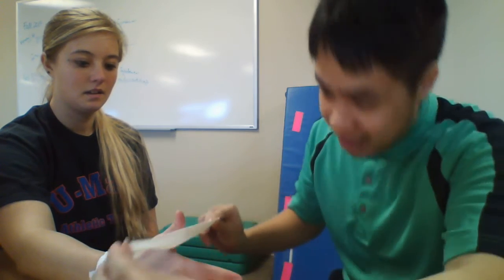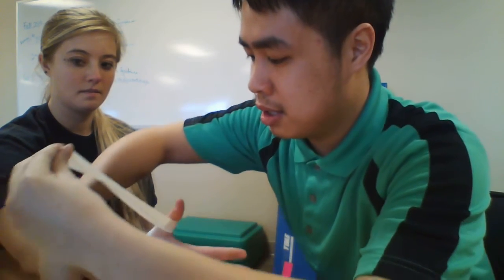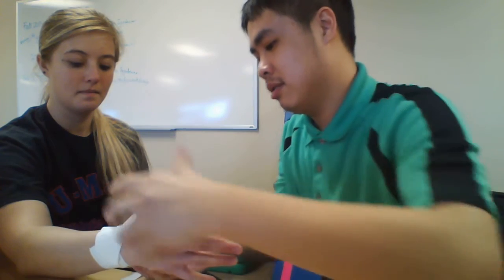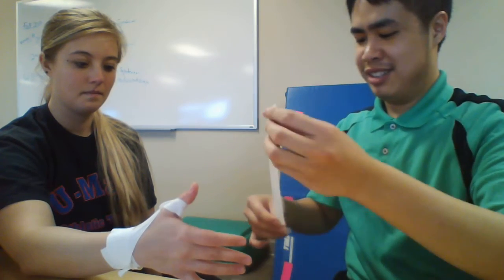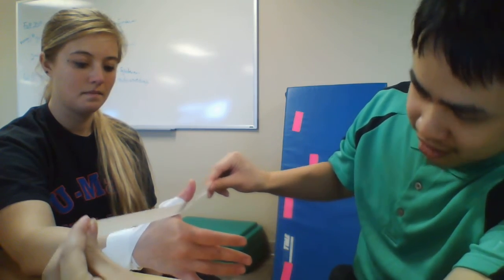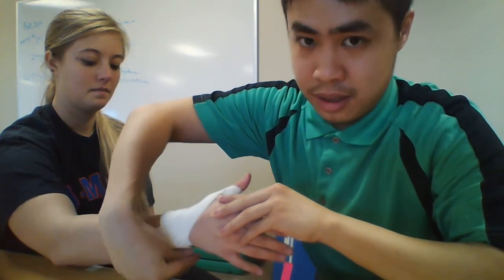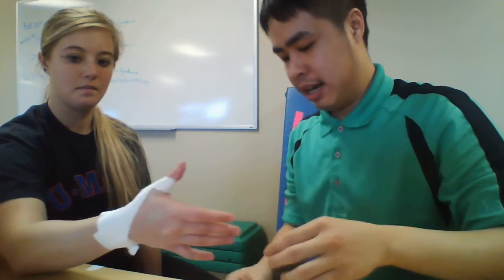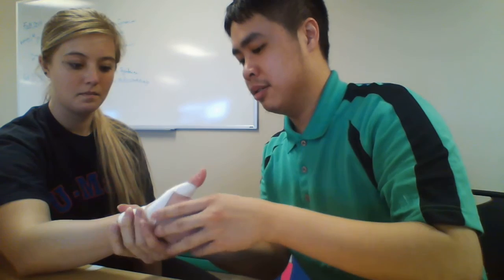I want to put it right at the IP joint and not in the thumb web space, so I want to get it right in the middle, bring it down over here, make sure it's moved out. I'll provide one more anchor strip, and this should keep her in that neutral position and prevent further injury of her thumb. This is a therapeutic device I would use.